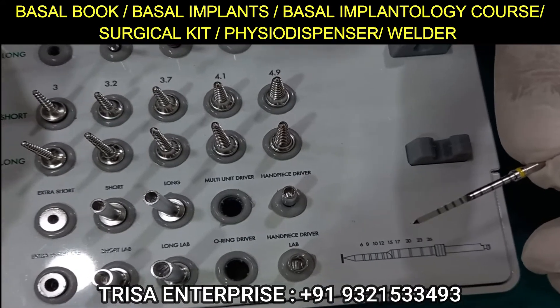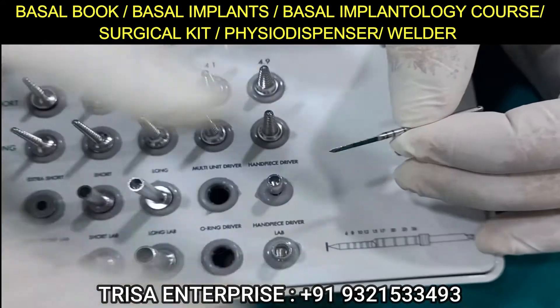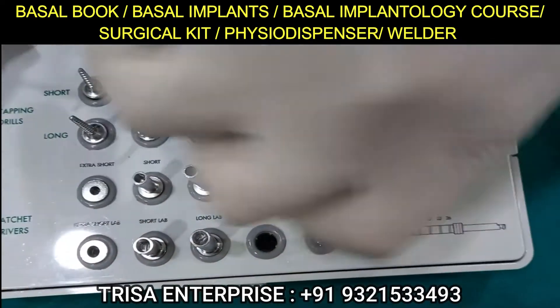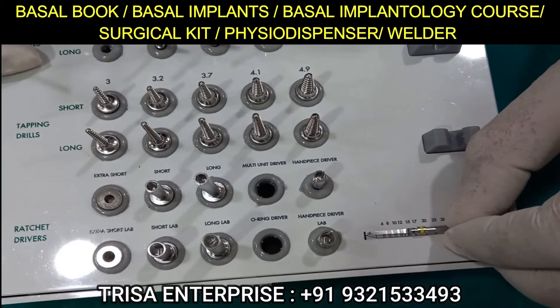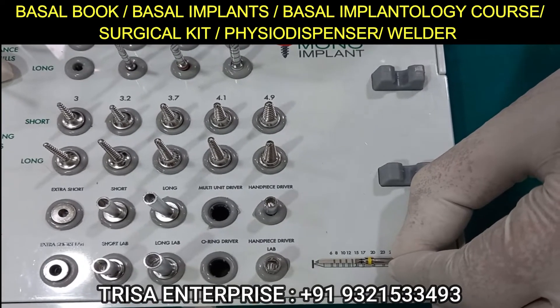Immediately above the dent there is a 15mm mark, then 17 and 20. Ninety percent of cases will complete within this range. Alternatively, you can use the shorter drill — in that case the stopper is fixed at exactly 20mm.